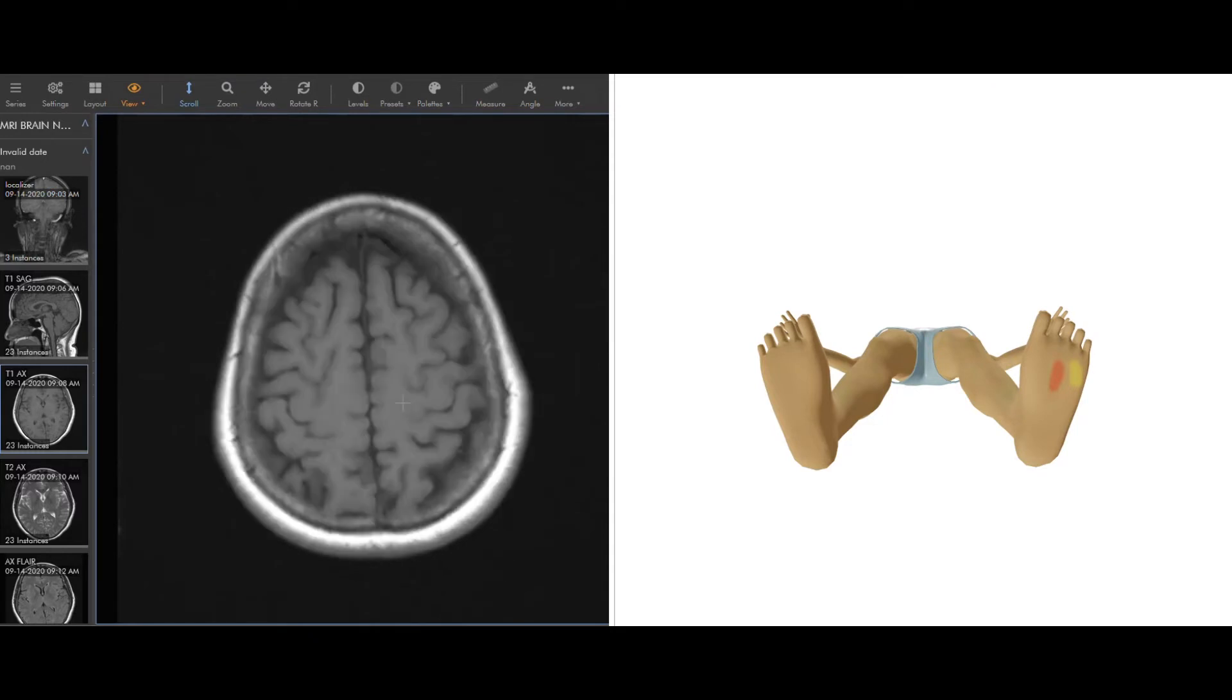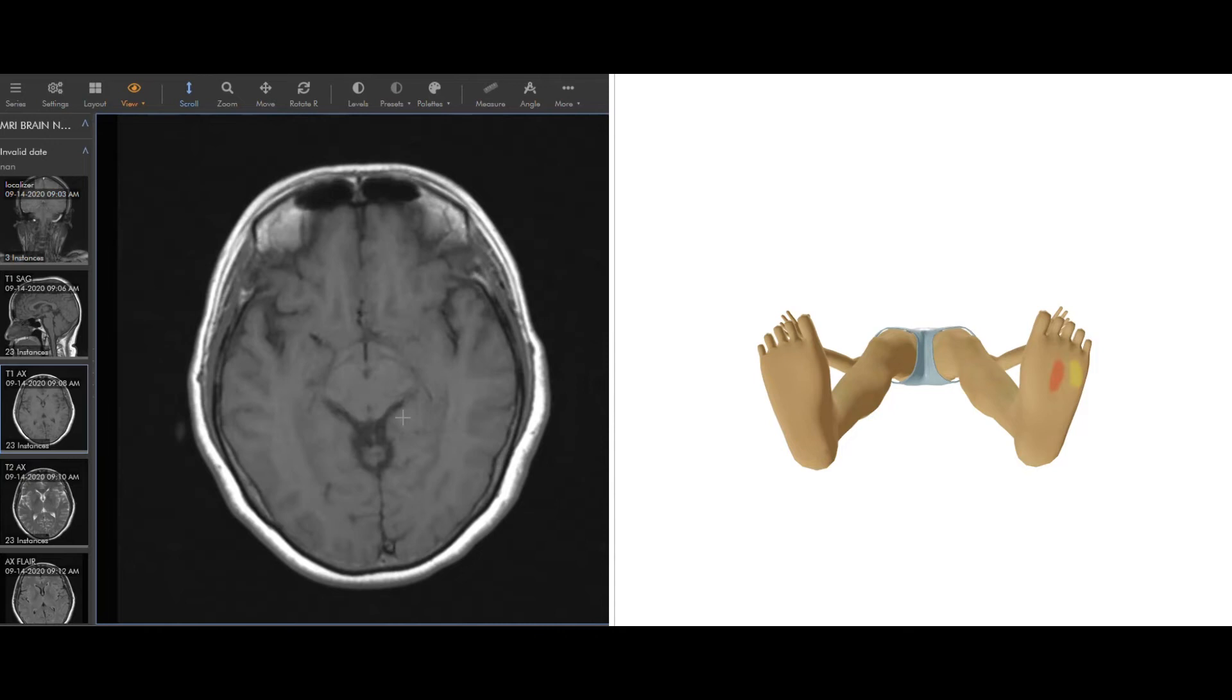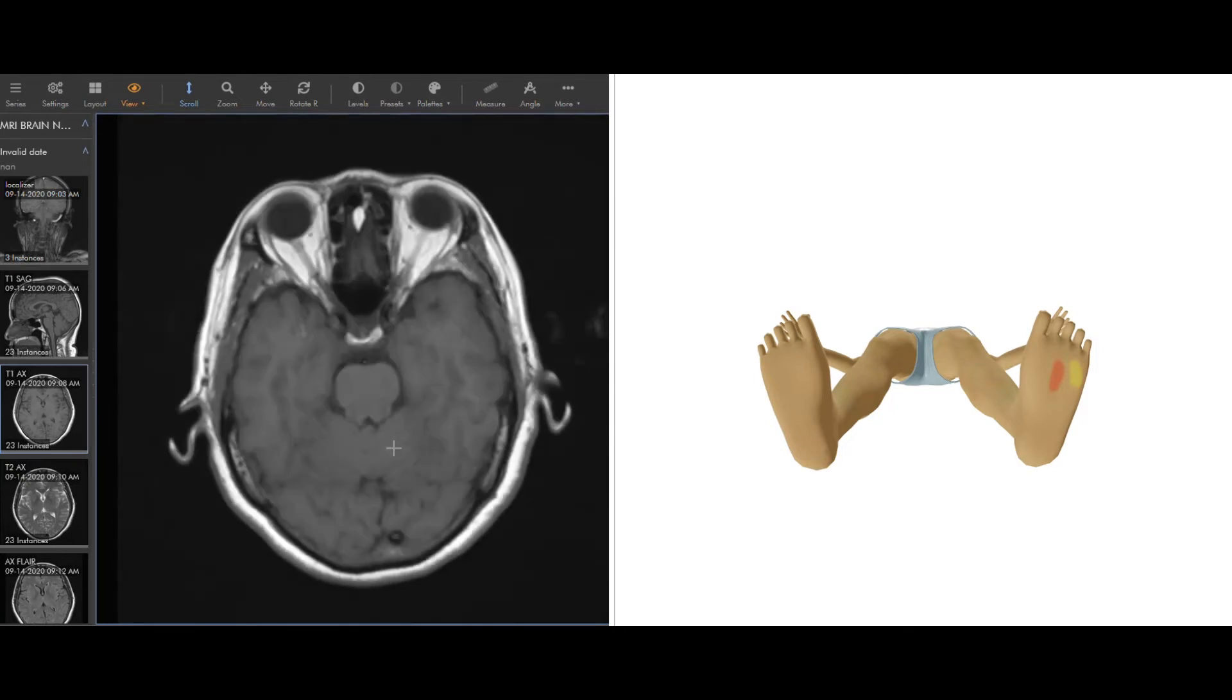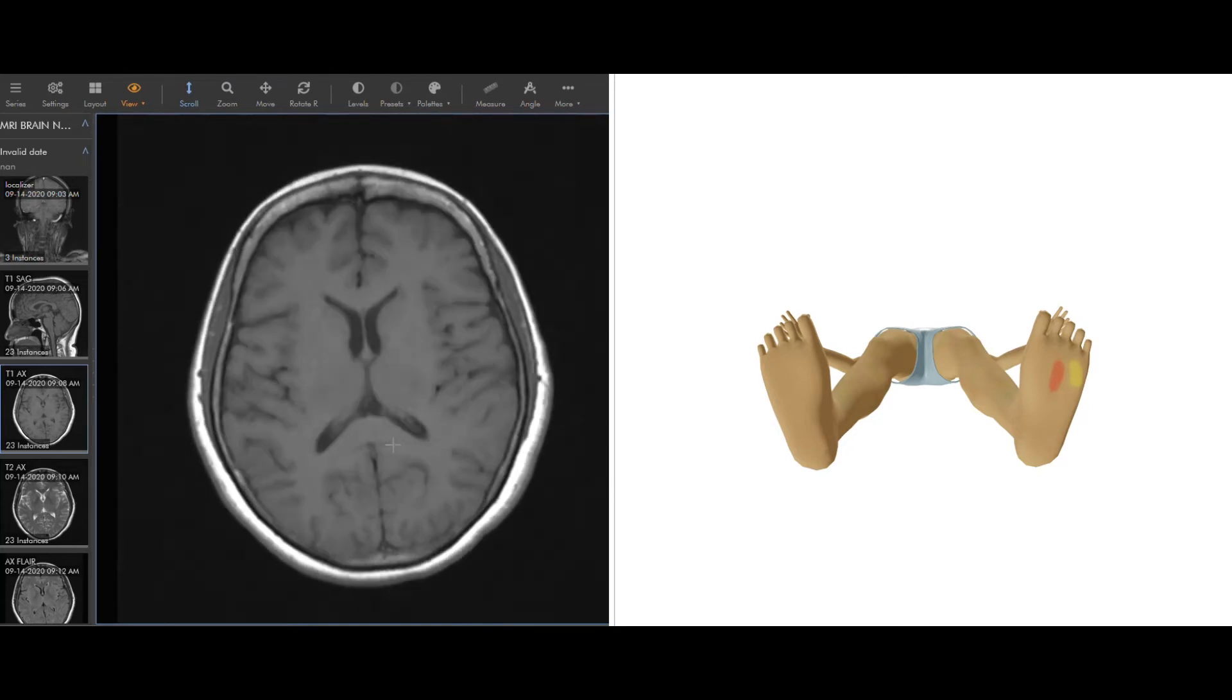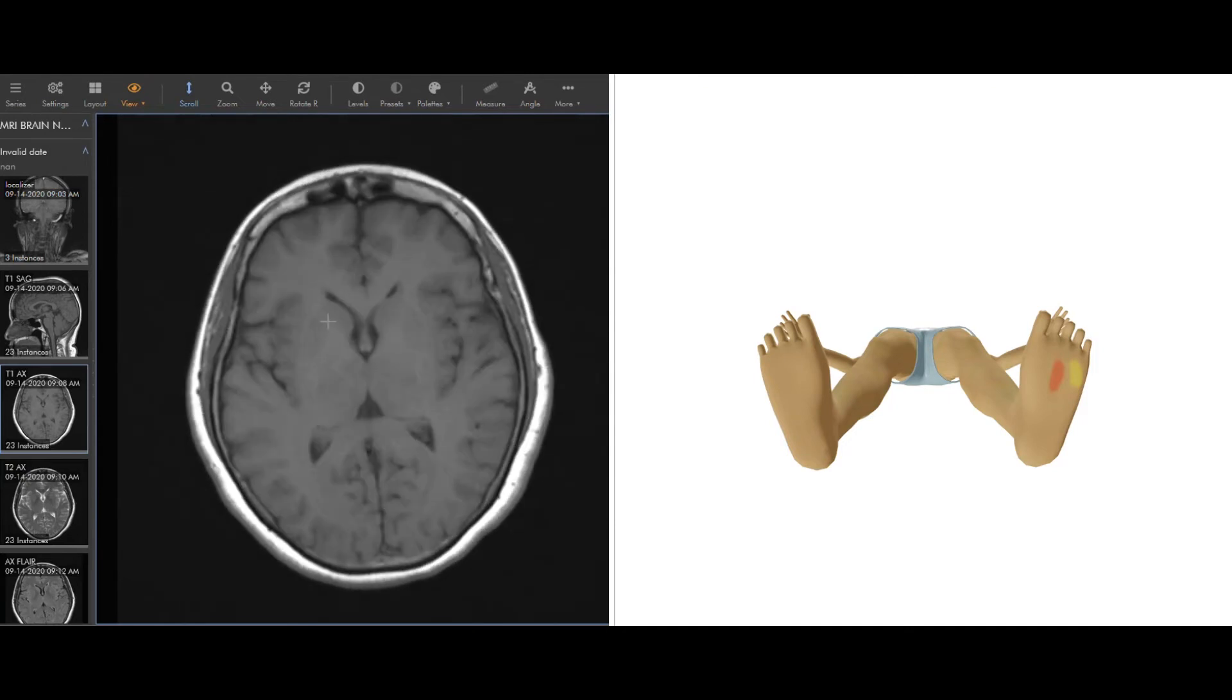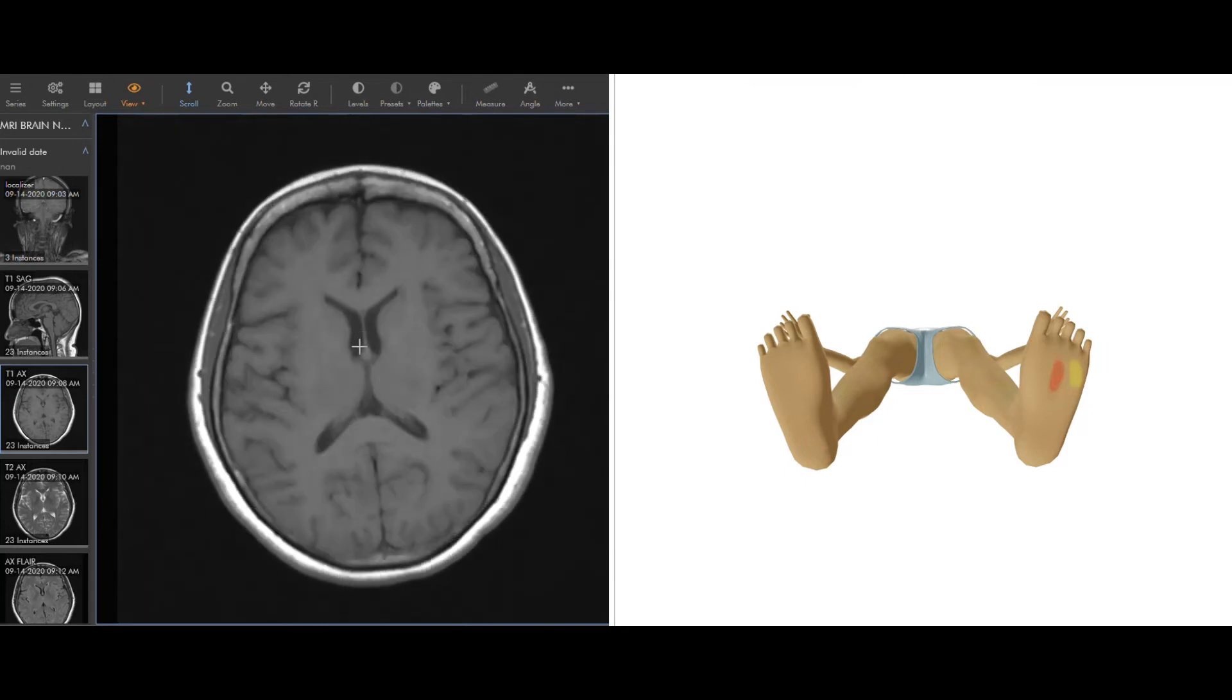As I go through one slice at a time, I'm going to start at the top of the head here, and each image is going to take me a little bit lower. As I go through like this, it's like slicing cross-sectionally and going down through the brain. This is the bottom here, this is the cerebellum, and then all the way up to the top. This is a T1 image, so just to point out here, white matter of the brain is a little bit brighter color than gray matter, which is lining the white matter here. And then the white matter is through here. Some of the central parts of the brain have some gray matter, this is called the deep gray, and then again, fluid is dark.